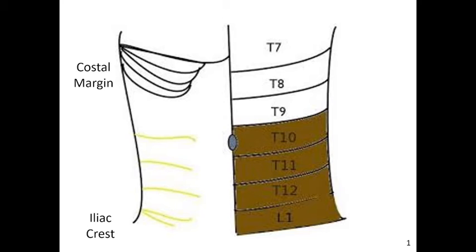This drawing shows the structures relevant to this procedure. The anterior abdomen is shown with the umbilicus marked in blue for reference.